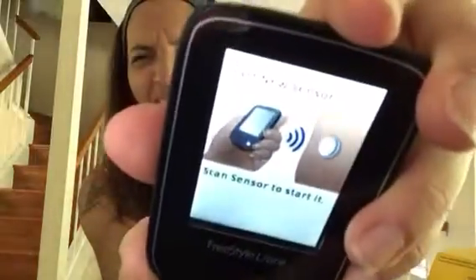It says 'new sensor found - starting a new sensor will end the sensor you're currently using, would you like to start the new one now?' I say yes. And here's the key part - this is what I missed: 'start new sensor, scan sensor to start it.' If you just saw 'start new sensor' you might think you're done, but you're NOT done - you actually have to scan it. Now it says 'new sensor starting up in 12 hours - sensor can be used in 12 hours.'